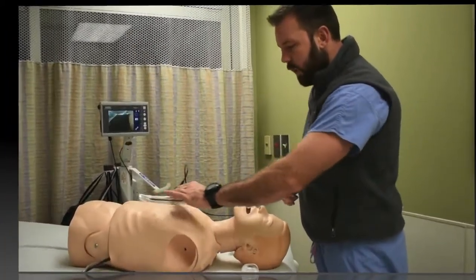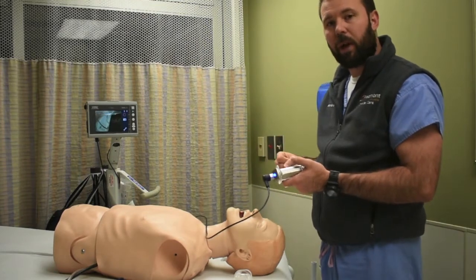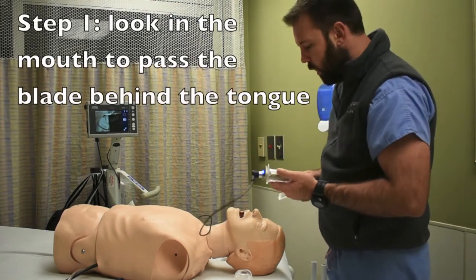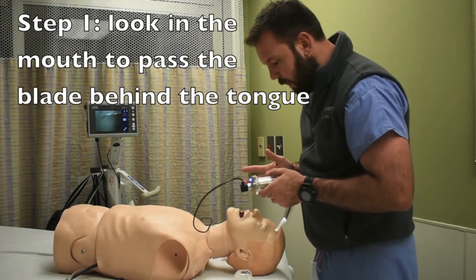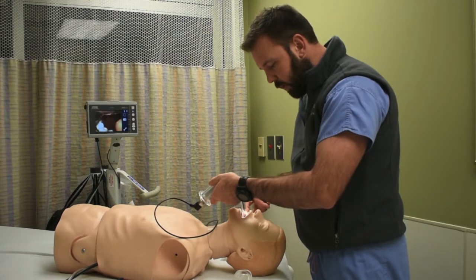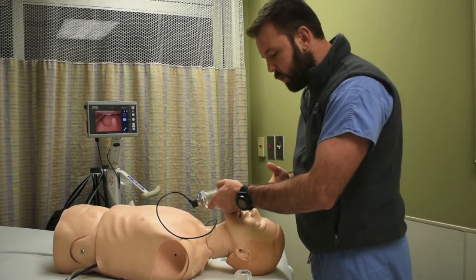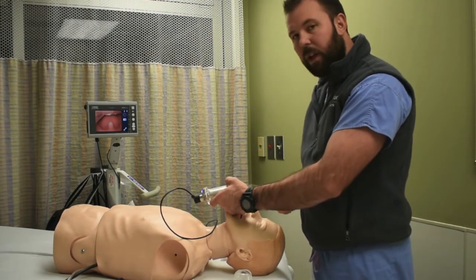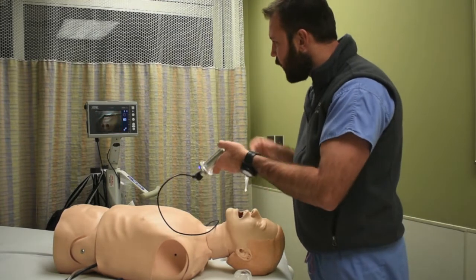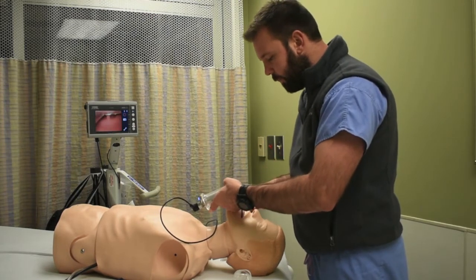Now, to introduce VL, I want to talk about 4 discrete steps that we should use every time we do a VL intubation. Step 1, look into the mouth. We want to make sure we gracefully guide the tip of the laryngoscope blade into the mouth, past the tongue without causing any airway trauma or damage to the teeth. The pitfall here is trying to look at the screen too early before guiding it past the tongue.